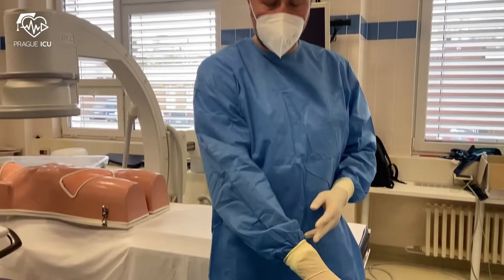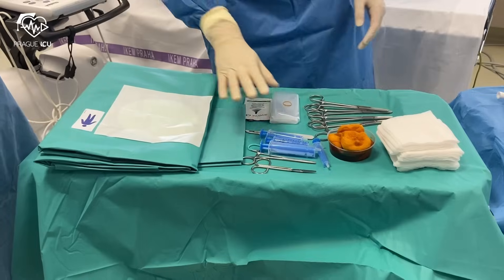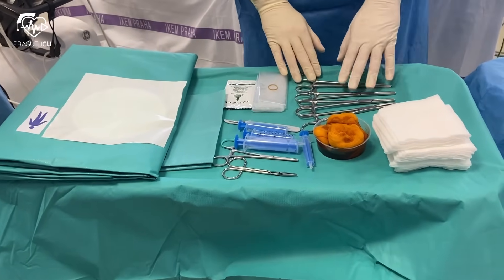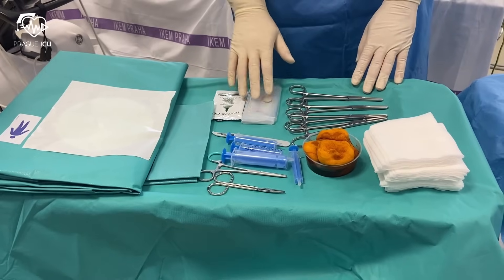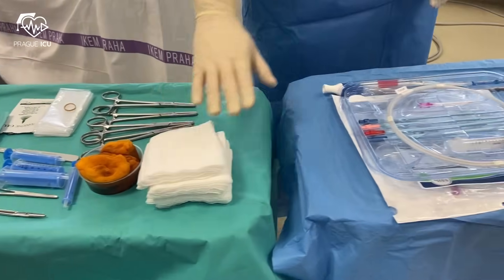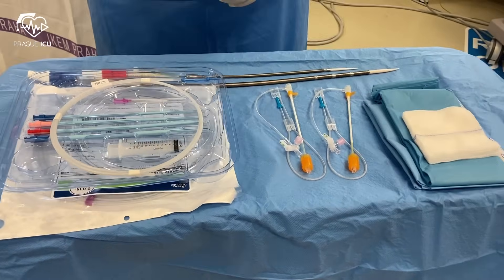For the procedure we have here two sterile trays. On the first one there is a big sterile fenestrated drape, syringes, scissors, four large clamps, sterile cover and gel, gauze pads with chlorhexidine and sterile gauze. On the second tray we have all the components for insertion of VA ECMO.